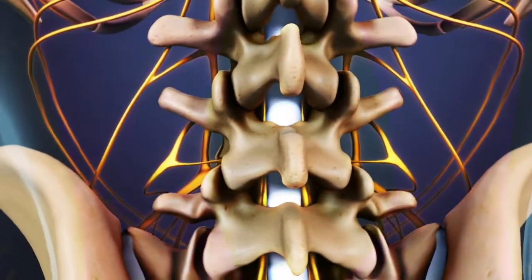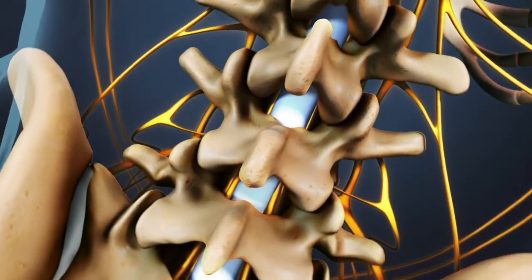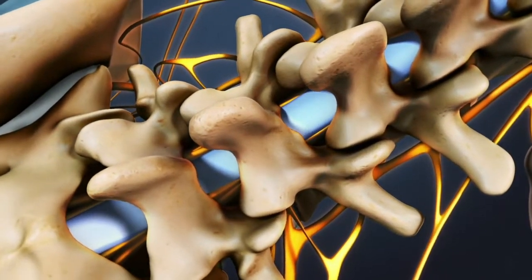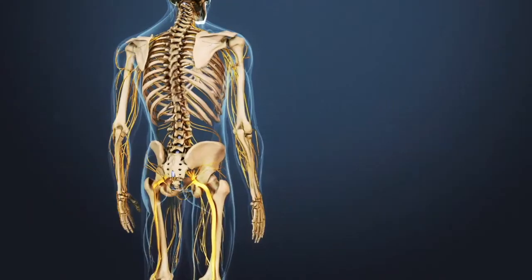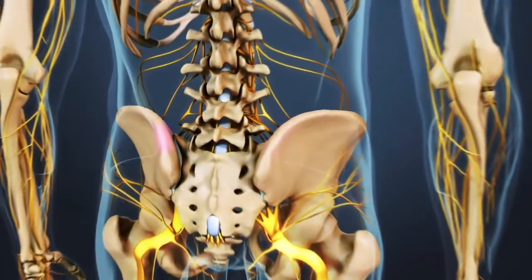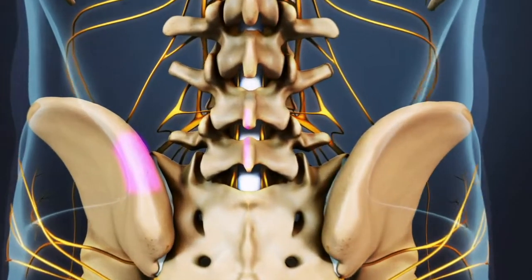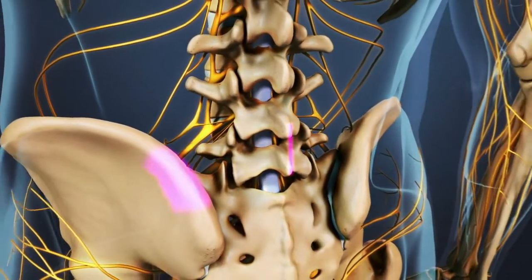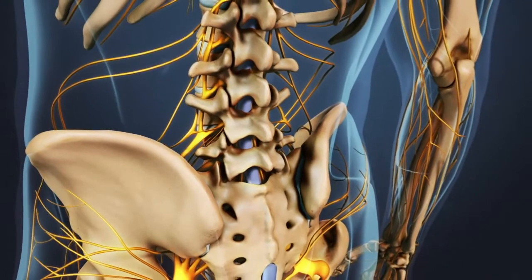If needed, the surgeon may also perform a laminectomy along with the fusion to remove arthritic bone or other material putting pressure on the spinal nerves. Bone graft is retrieved from the iliac crest, the uppermost portion of the back of the pelvis. Most surgeons use the same incision for retrieving the bone graft and for the fusion. Synthetic or cadaver bone graft may also be used.